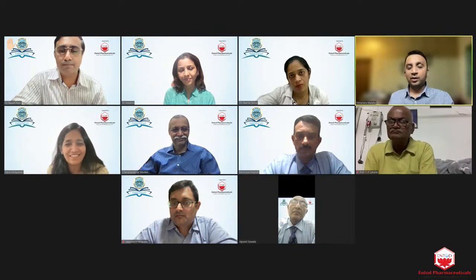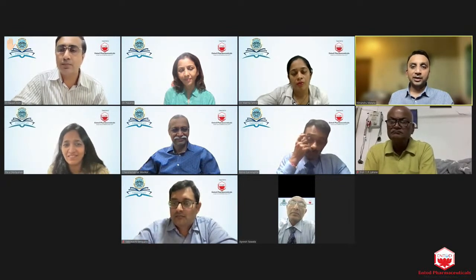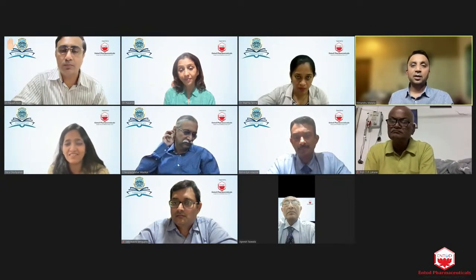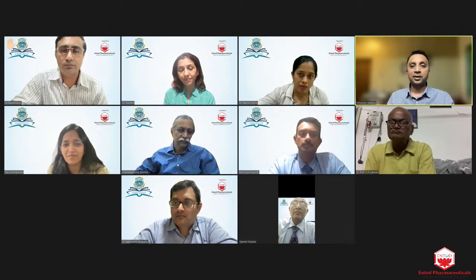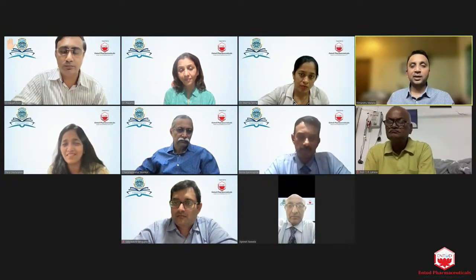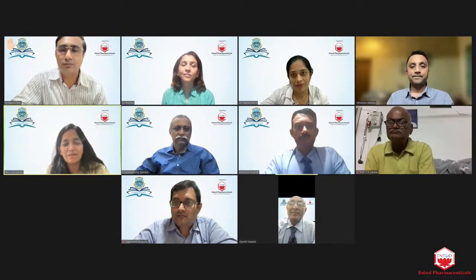No, so I would never ever rely upon one particular thing. I always consider Pentacam as my topographic measurement partner, and IOLMaster 700 as my keratometric preferred partner. And when both of them match each other, I would be really happy. When they don't talk to each other, well, I'm not happy there. Well said, sir.